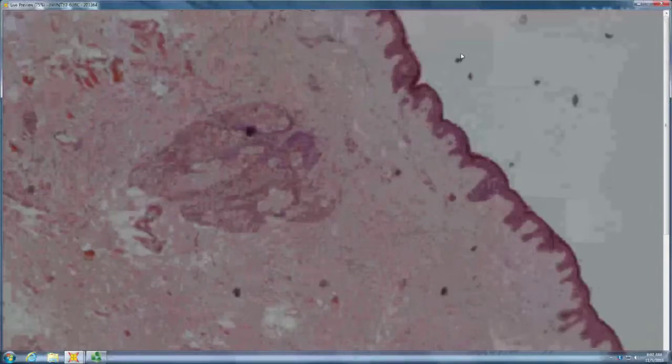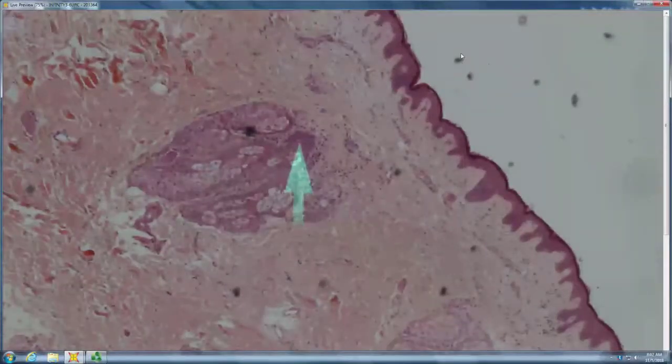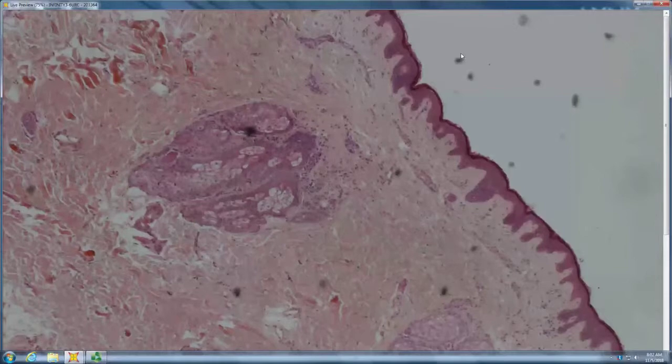So what kind of alopecia do the hairs become? Tiny, tiny little vellus hairs, and the follicles have just kind of converted to sebaceous. Pattern alopecia? Yeah, end-stage pattern. Okay.